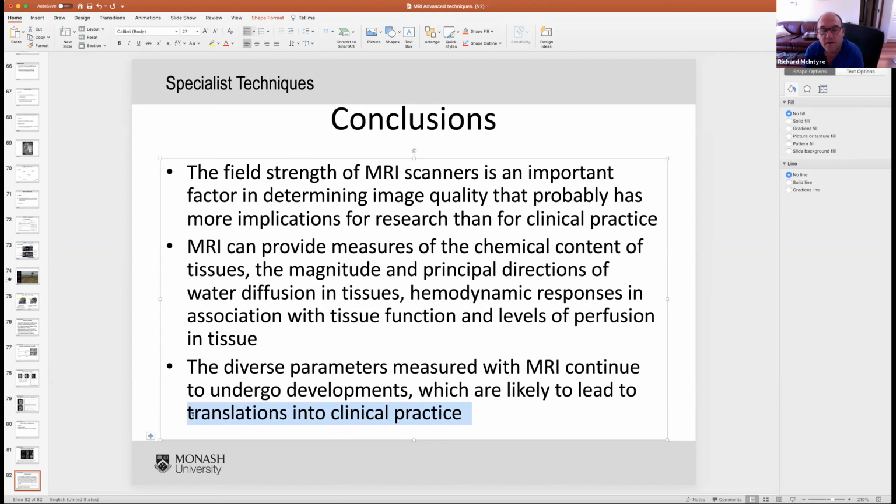So we have biomarkers, all right? We can do a functional MRI scan and we can see, okay, there's activation in this part of the brain when we're giving the stimulus, in which case that person is more likely to develop schizophrenia or some sort of post-traumatic stress or some sort of reaction as part of that. And I think in your careers, it's going to be very, very exciting, the types of scanning that we can do.